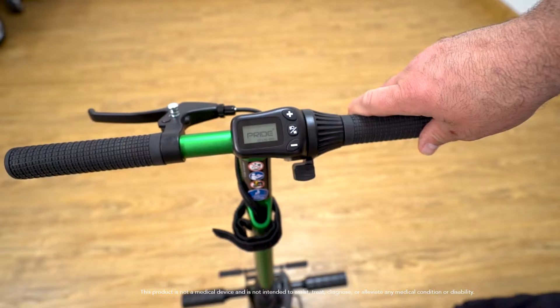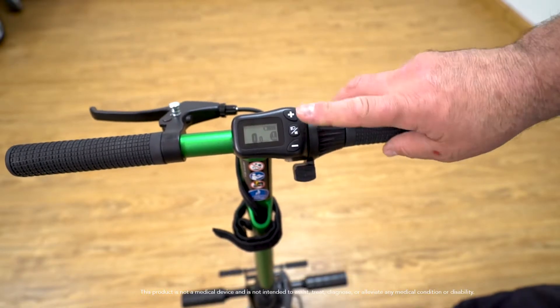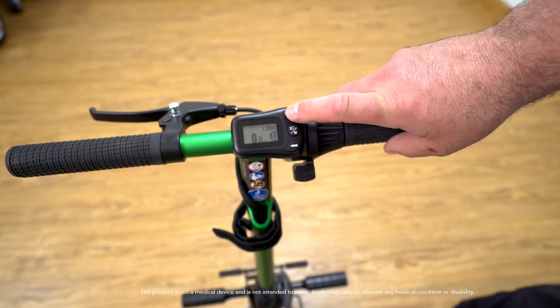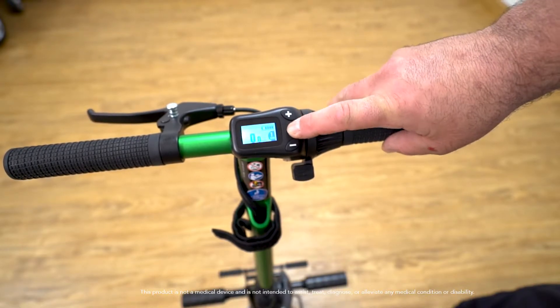The console will display when power is on. The console will have two settings for speed: number one is set for the slower speed at 2 miles per hour, and number two is the faster speed at 3.7 miles per hour. To change the speeds, simply press the minus or plus button. There is also a light on the console.